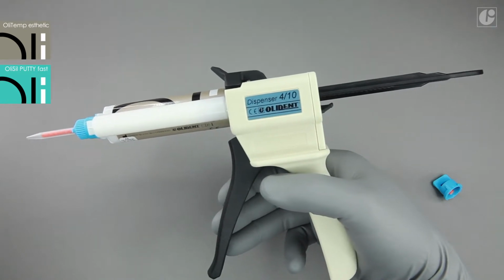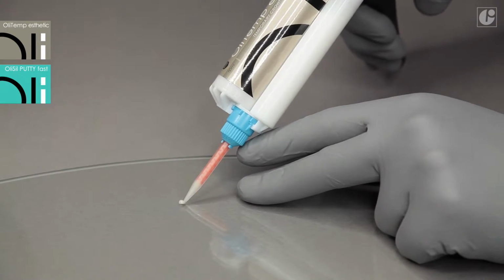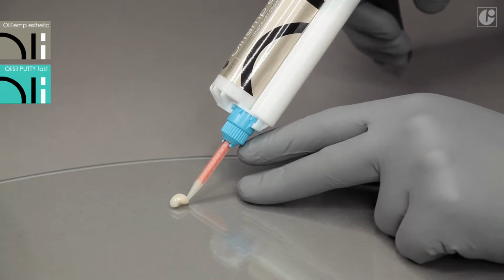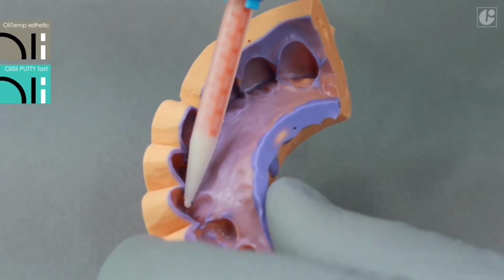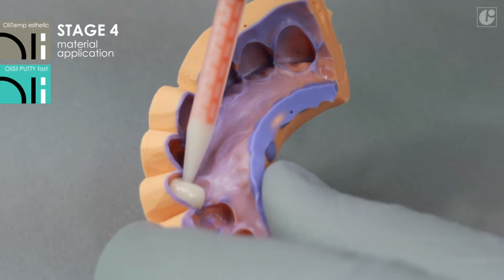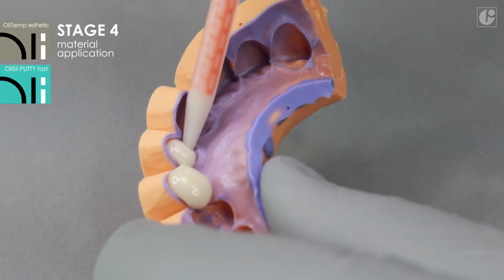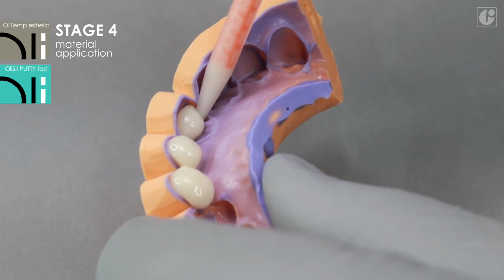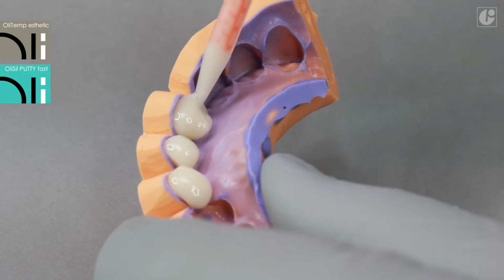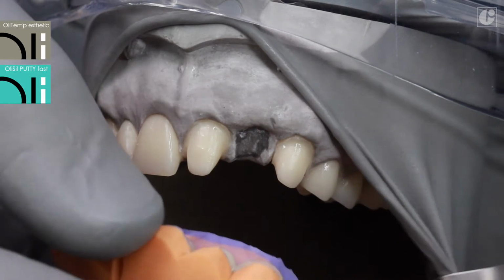Just before the first application, squeeze out a small amount of the material and discard it. It is commonly recommended for dual curing materials to level the base and the catalyst in the cartridge. When applying OliTemp Aesthetic, the mixing tip should be immersed in the material at all times to prevent the formation of air bubbles. This way, future corrections of the restoration can be avoided. Reposition the filled impression into the oral cavity within 1 minute from the start of OliTemp Aesthetic application.